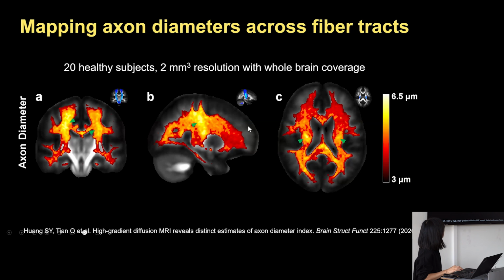And this also agrees with studies that people have done in non-human primates and also in humans. I think there was a paper published by Leewald from the MPI of Biological Cybernetics here, where he actually looked at the human brain, four human brain specimens, and showed that you actually do have different diameter axons in different portions of the brain.